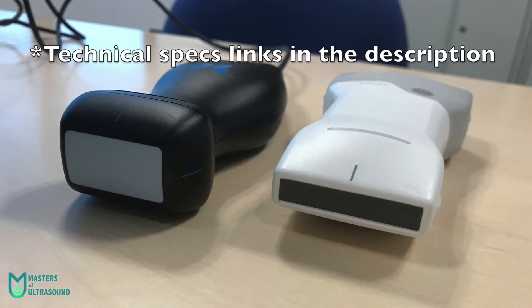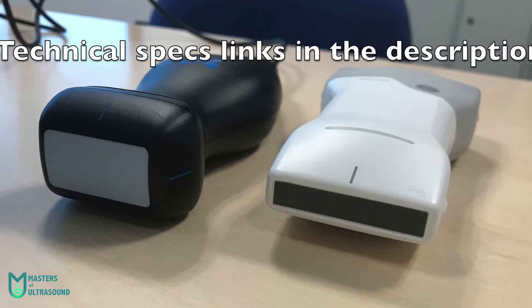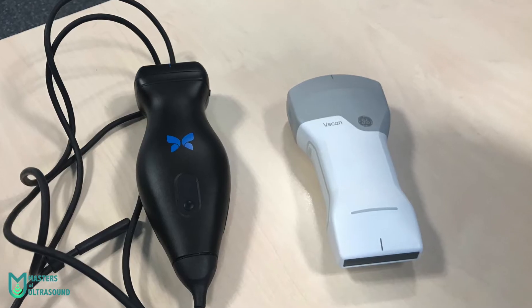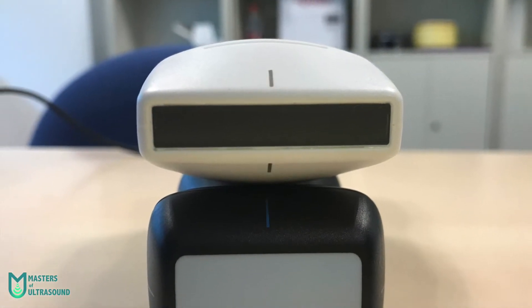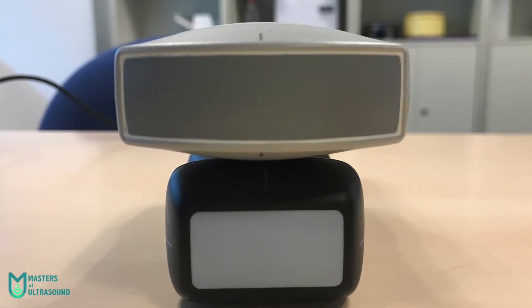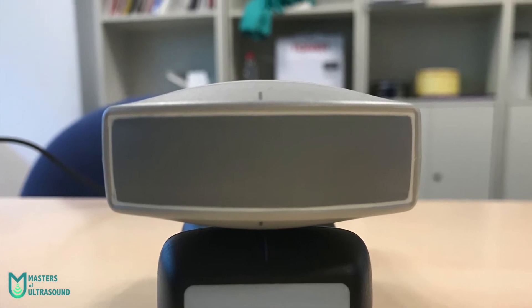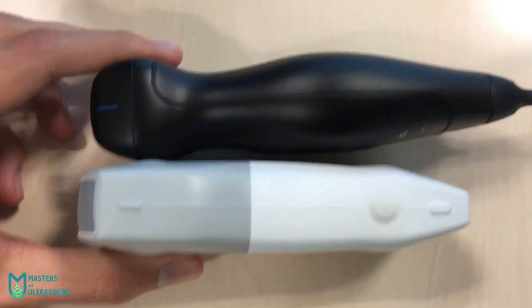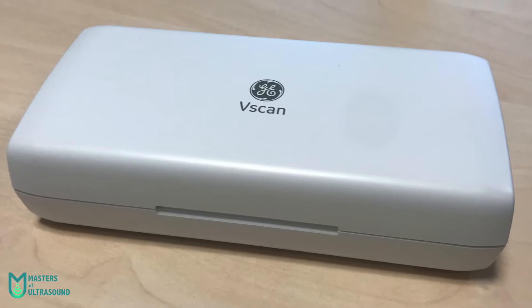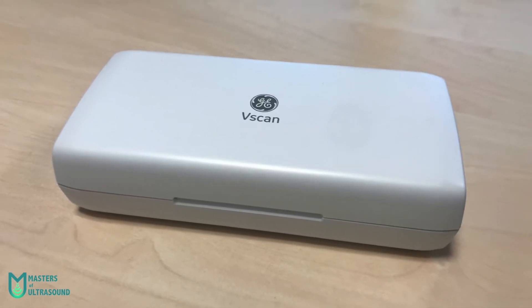While you're viewing these images, let me tell you about some features that make these devices unique. The Butterfly IQ has more modes than the GE Vscan Air, such as M-mode and Pulse Wave Doppler. It also has tools to automatically calculate left ventricular ejection fraction and bladder volume, plus a needle guidance system called NeedleViz that allows both in-plane and out-of-plane approaches — the longitudinal and transverse axes.